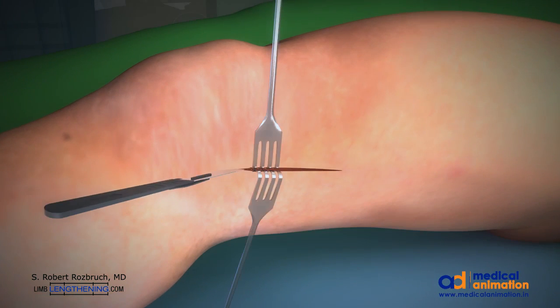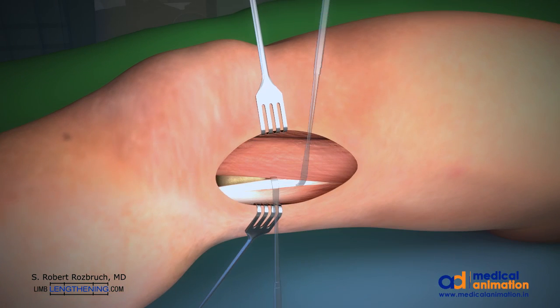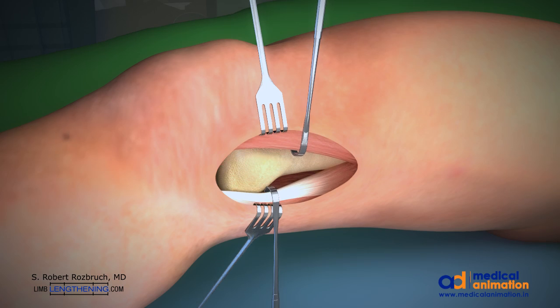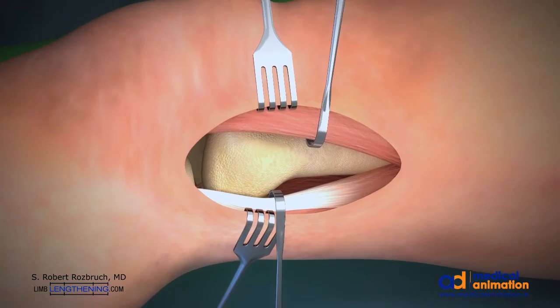We make a 4-inch incision on the lateral aspect of the leg. We dissect the vastus lateralis anteriorly, exposing the lateral aspect of the femur.